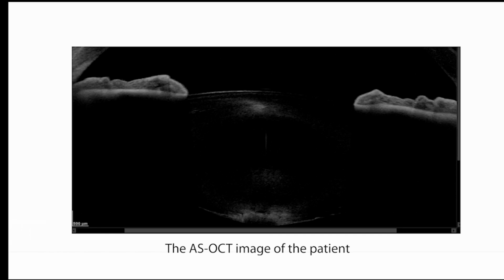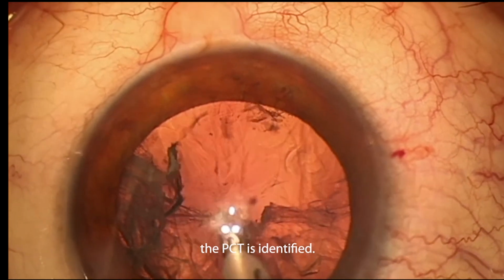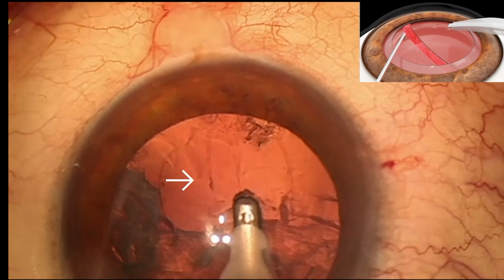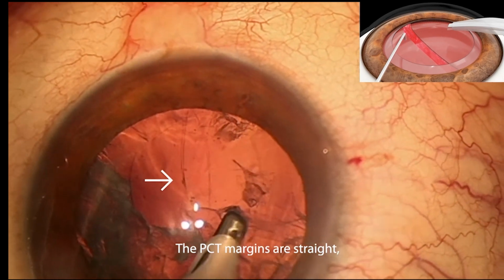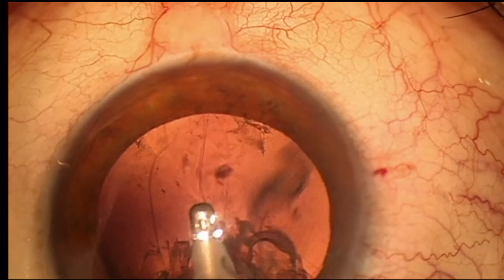ASOCT image of the patient confirms the presence of a pre-existing PCR. Intraoperatively, the posterior capsular rupture is identified, and it is observed that the tear edges are motile and demonstrate the Flutter sign. The PCT margins are straight, further supporting the integrity of the anterior hyaloid face.